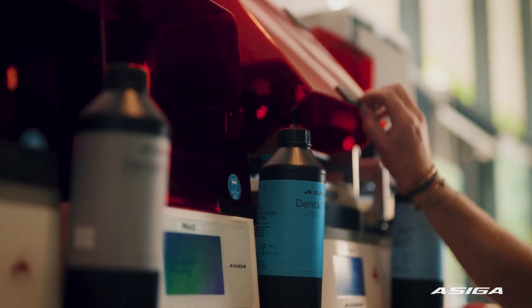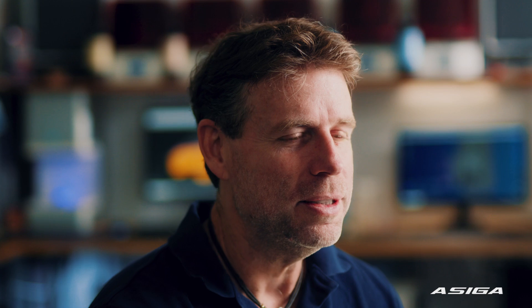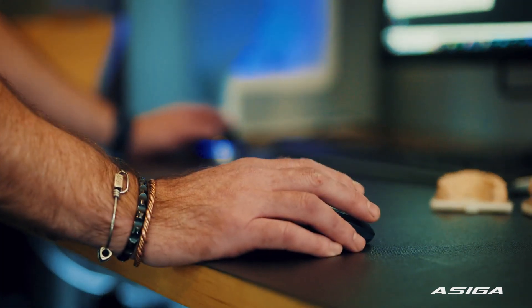I love what I do. It's a fun job. I love working with my hands. I've got all these toys to play with. The toys have made my job easier — it's taken the hard labor work out of it. You can be more creative at the end, and more importantly, you're giving the patient a better result.